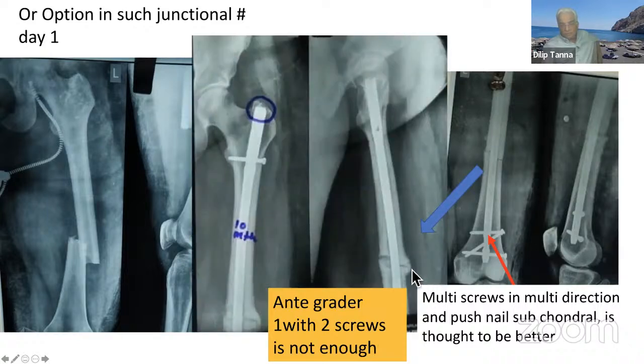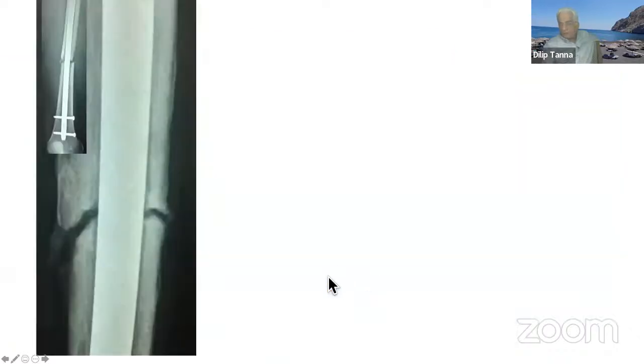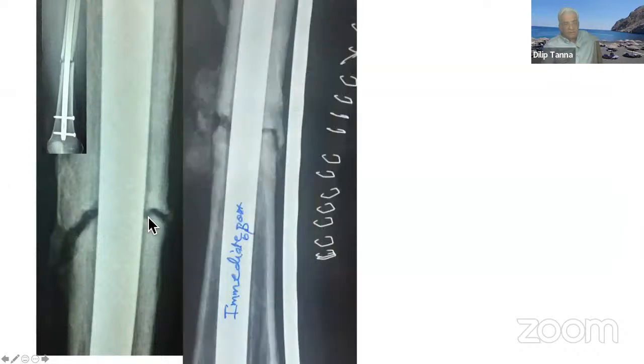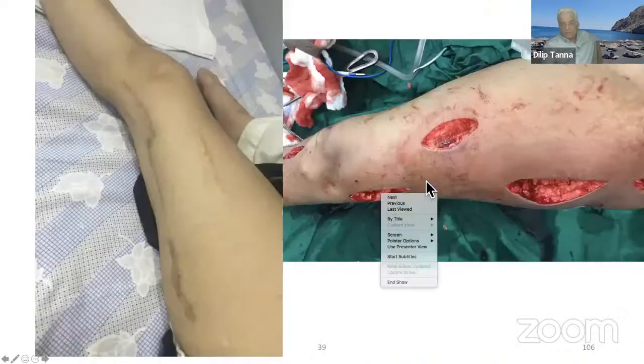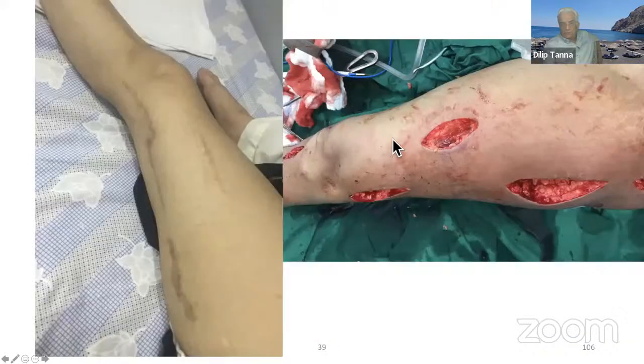And this one also went into non-union ultimately, and we had to treat it. Here is the fracture, where you can see the non-union, and a supplementary nail and a medial graft. And then it has healed up completely. And I have removed the implant also, as you can see here.